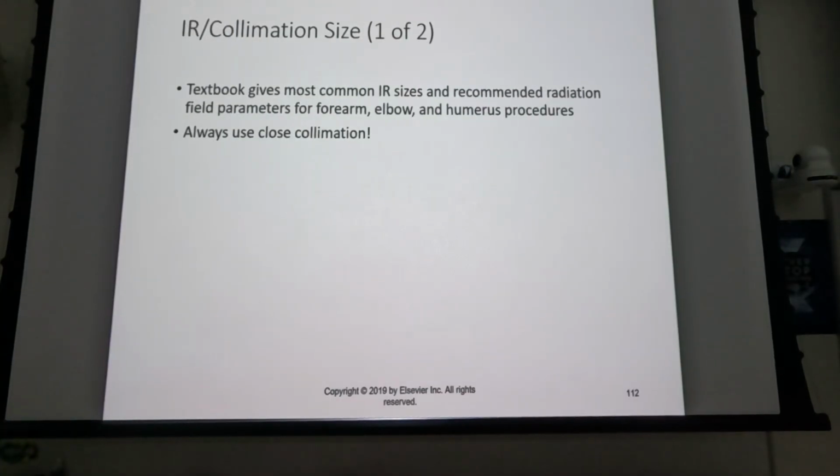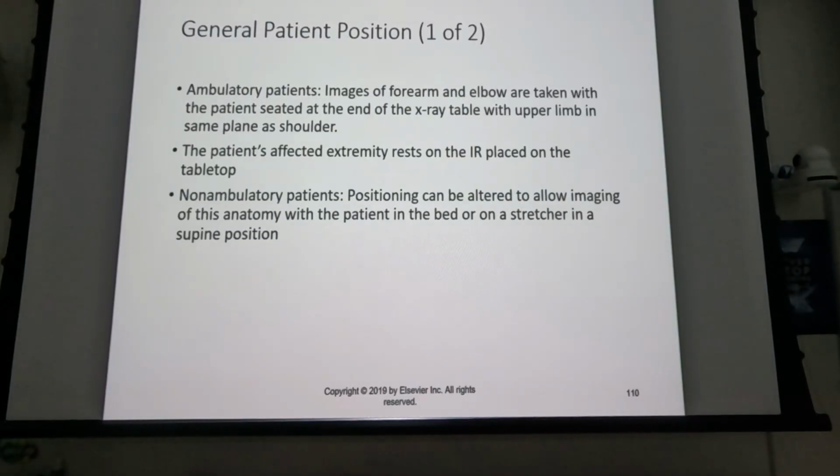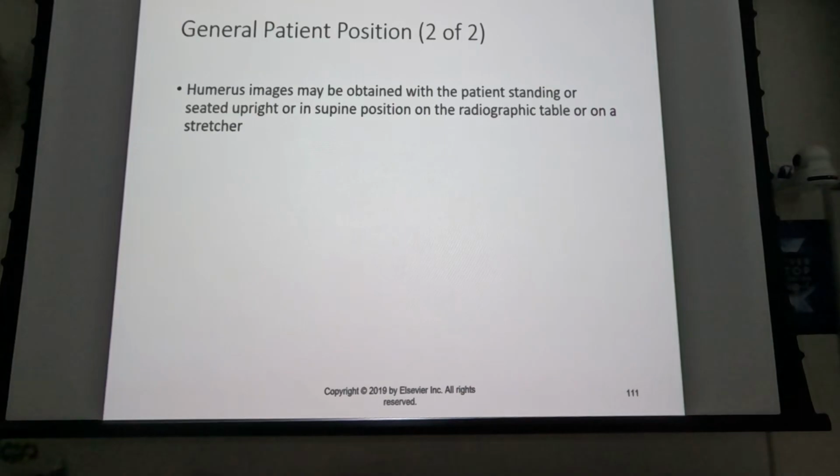All right, so all this stuff is pretty much a repeat of what we've talked about before. Dress the patient, take off watches, take off bracelets, take off whatever can come off the patient for this particular exam, or the exam that we're going to be discussing at the time. It needs to come off the patient if at all possible. If it won't come off, that's okay as well. But try to take anything off of the patient, give it to the patient, and consider body position.